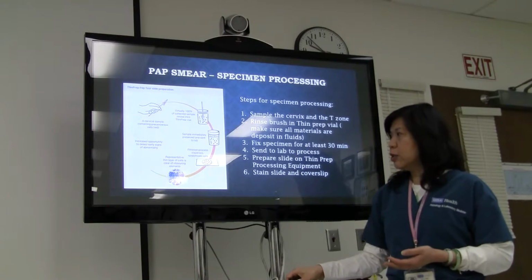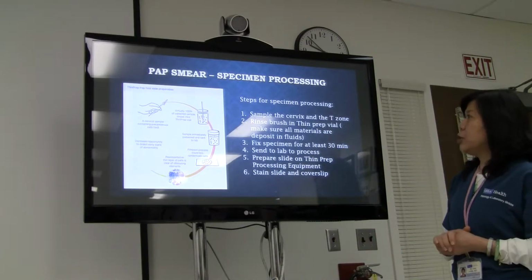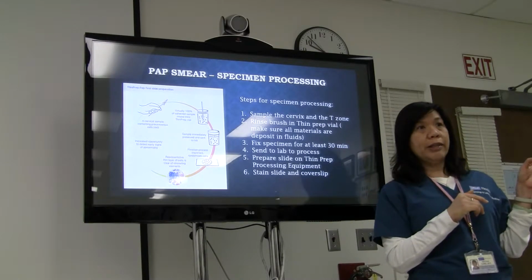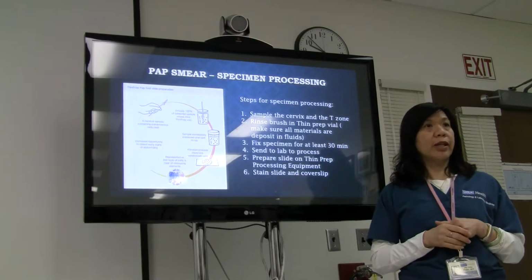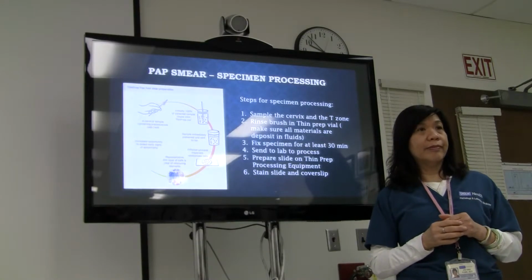Okay. So, let's see. It's only 10 o'clock. Let me check with the lab real quick. If they have an opening, then I'm going to bring you into the lab and show you how to do this part. Okay? All right. Any questions so far? Yes.